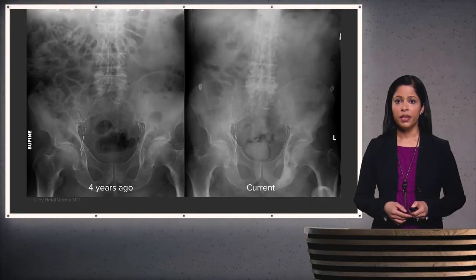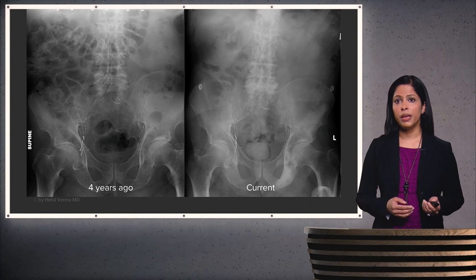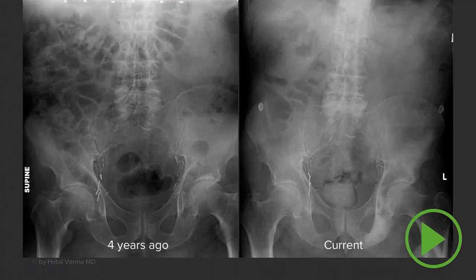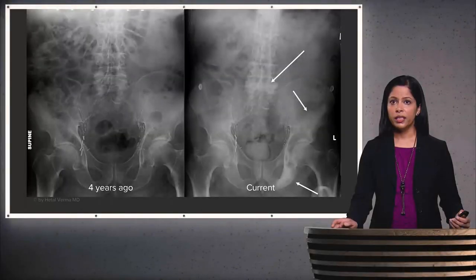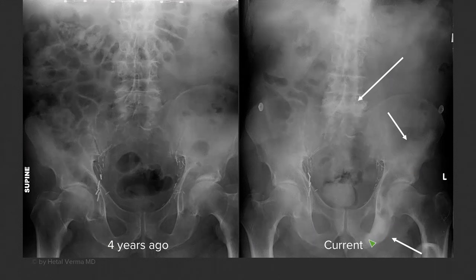Let's take a look at this case, focusing on the bony structures. Can you see the difference between the image obtained four years ago and the current image of the same patient? The areas that look different include an increase in density within the lower lumbar spine, an increase in density within the iliac bone, and an increase in density in the inferior pubic ramus when compared with the prior.